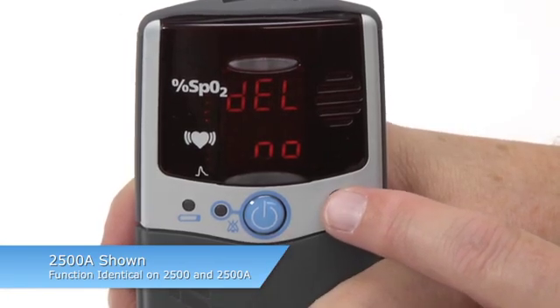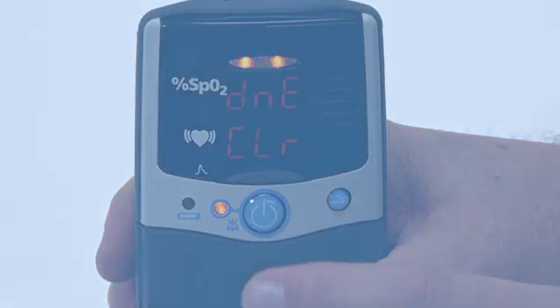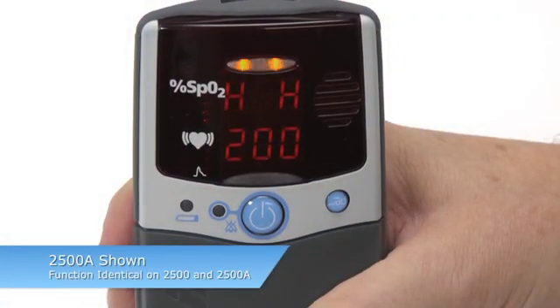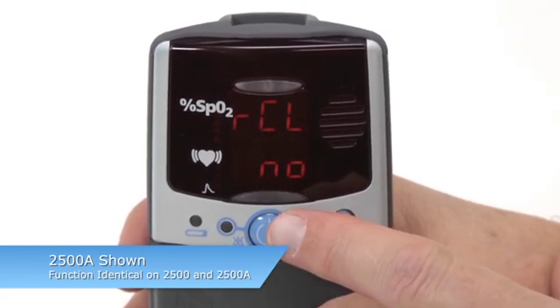Delete will appear. Confirm that you want to clear by pressing ON-OFF again. You will automatically exit Setup Mode. Re-enter Setup Mode and select CLEAR NO to proceed to the rest of the setup options.